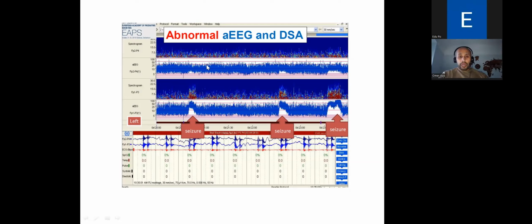Someone has quite rightly pointed out that the focus is on the left side here. Occasionally with seizures in a completely sedated child, you might get some physiological indicators, like pupillary changes or a change in the heart rate or blood pressure, which might make you suspicious of a potential seizure. But this provides electrographic evidence of that.